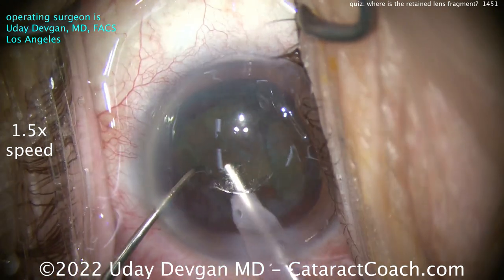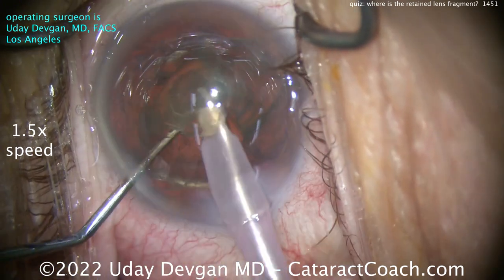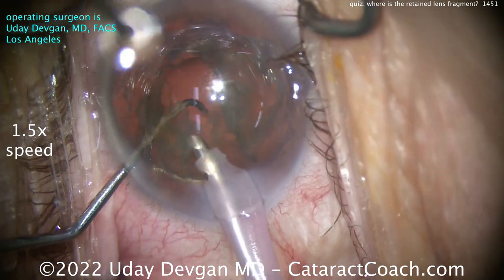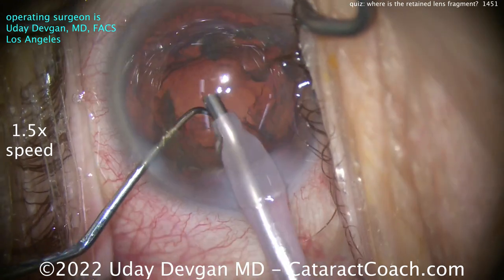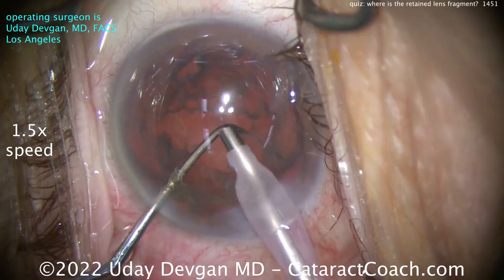I've kind of chopped it in half — this is not a super elegant case, it's not a cherry-pick case, it's a routine case. We're finally getting the pieces out, nice and easy, emulsifying those. Soft lens, so we don't want to put too much energy in the eye. Now we just have an epinuclear shell remaining, let's get that taken down.